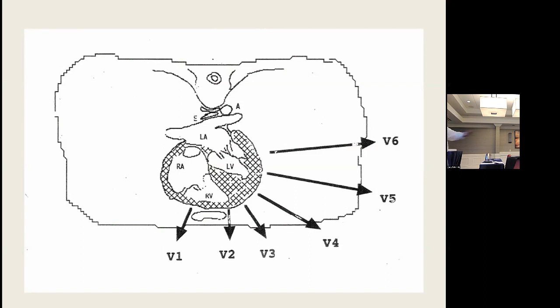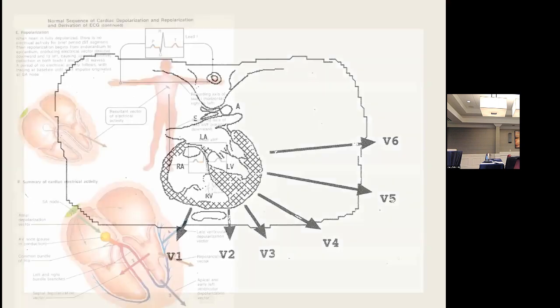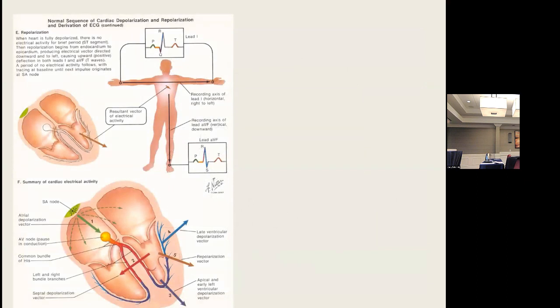So it's not a perfect view of the floor. It's kind of a floor that goes like this. Why like that? Because that's the way the left ventricle goes. You want windows to look at where you're going to have cardiac activity. Okay. And think about it: electrical force is equal to the amount of myocardial tissue. The larger the tissue, the larger the force, the larger the vector. And we're going to see how that translates on an EKG in a second.